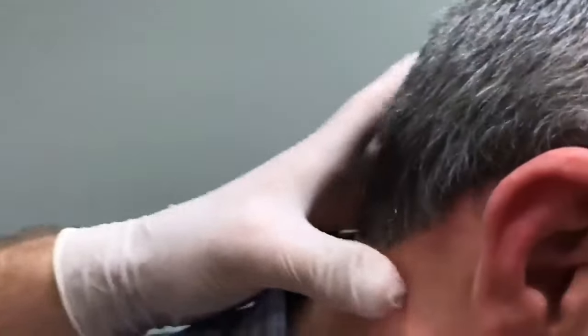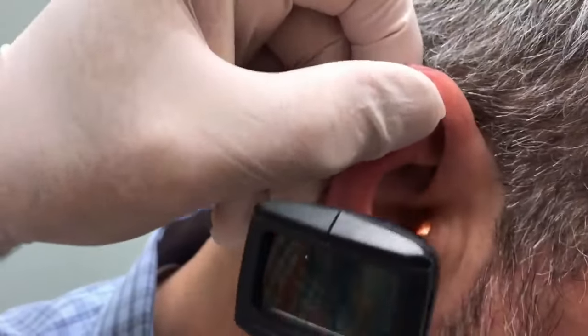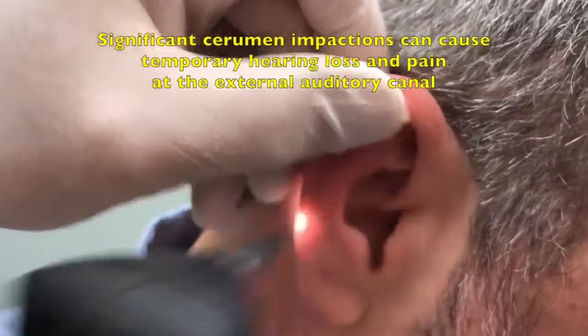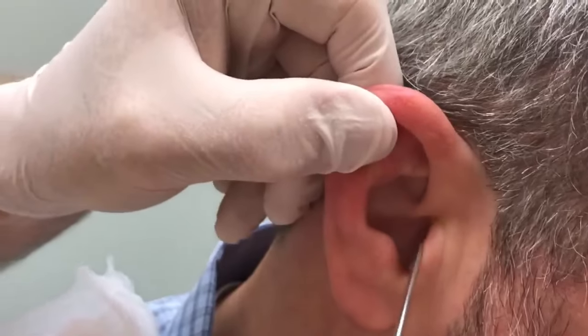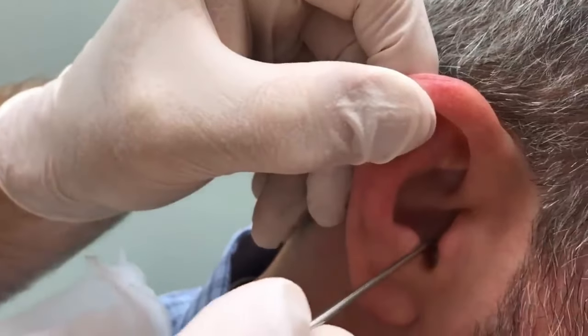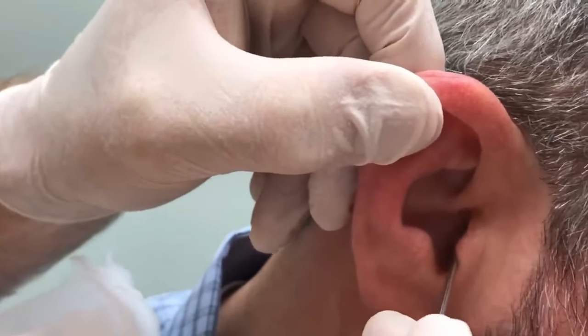So what we've decided is that you have a great deal of cerumen impacted in that ear. Can you turn just a little bit right there? I'm going to take a look in there again, and we're going to see if we can get in there and get this for you. It's rather impressive. Well, my family's saying anything worth doing is worth overdoing. All right, just hold real still. If it hurts, you're going to tell me. We're going to see if we can gently get that out for you.